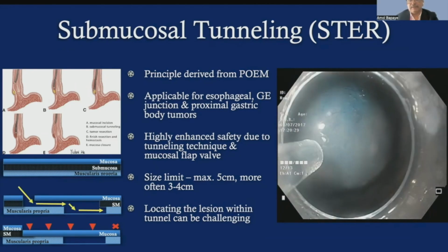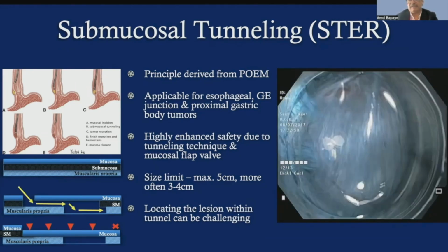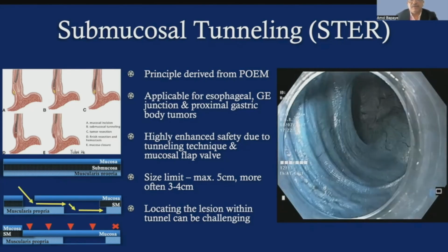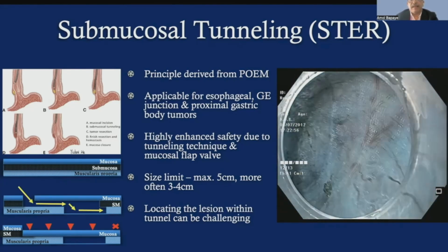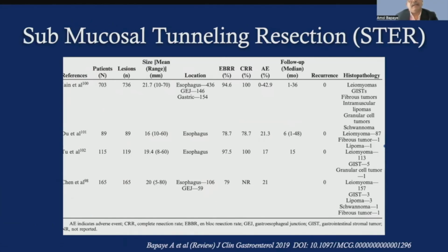The challenge is that tumors up to 3 to 4 centimeters can be resected very easily, but as the size of the tumor increases, very often things can become difficult and the procedure becomes more challenging. But in general, we can see that the results of STER are excellent, with excellent en bloc resection rates and minimal and acceptable adverse events.